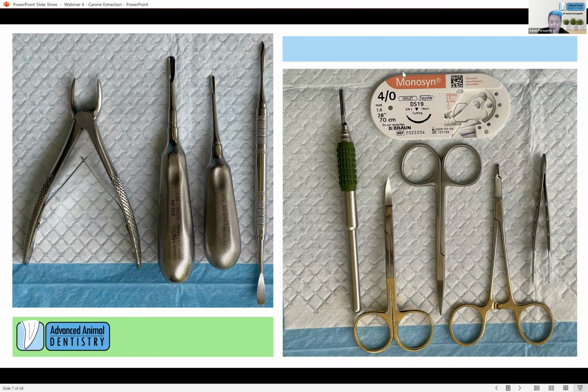We are working in a pretty small area, and over the years and certainly into the future we'll continue to do so, we put together our surgical kits that are aimed at these smaller surgical areas. So we use pretty fine instruments, as you can see, but they're not complex. We have a scalpel handle, gone are the days where we wrap it back in the foil that it came from. We have sharp scissors. These iris scissors that Beck has here, they're really lovely, nice and sharp.